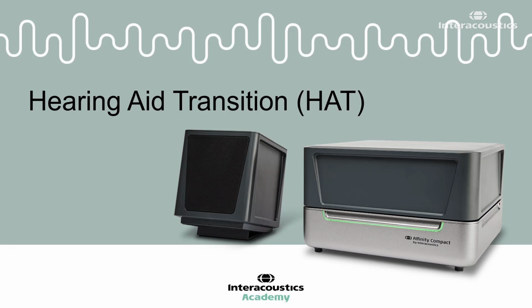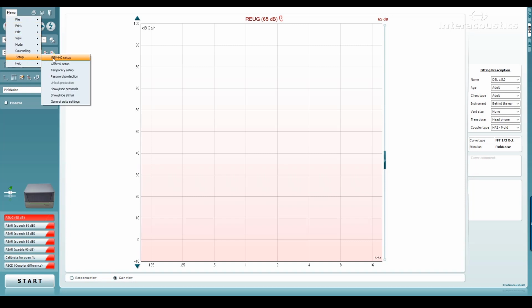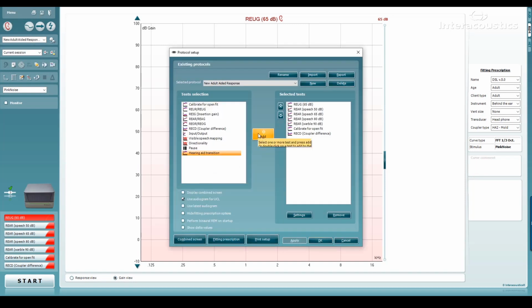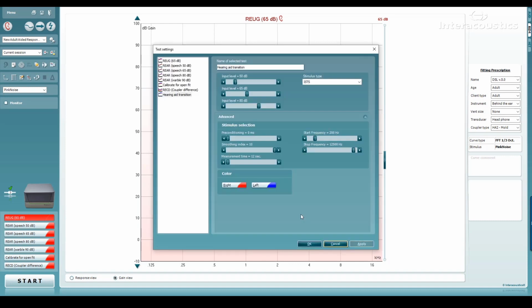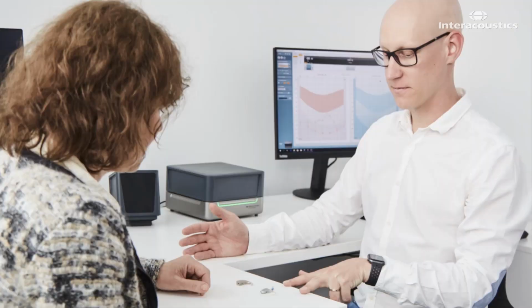This video explains how to find and use the hearing aid transition function in your Affinity Suite software. To begin, you will need to add your hearing aid transition measurement into your REM protocol in order to use it. This is done in the protocol settings. Hearing aid transition measurements can be performed both on-ear and in the coupler. The hearing aid transition feature has been created to help you retain the patient's audibility preferences from their current hearing aids during the upgrade process.